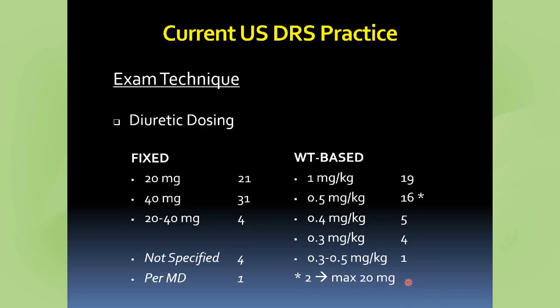And my thoughts on that is certainly, my concern is if I gave 20 milligrams to a patient and I got equivocal results, I worry I should bring them back and repeat at the standard dose of 40 milligrams to make sure that it's truly equivocal and not maybe normal and I just underdosed them with the renal Lasix.